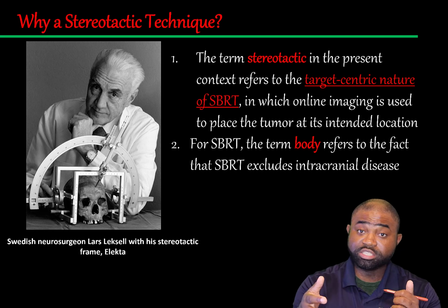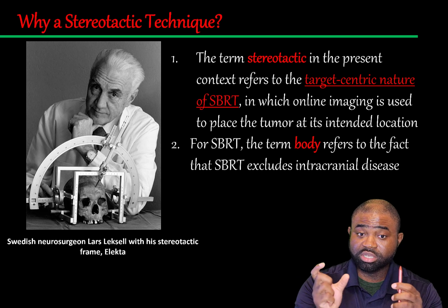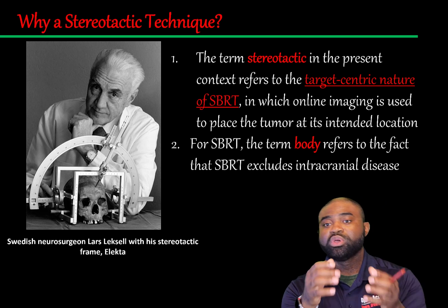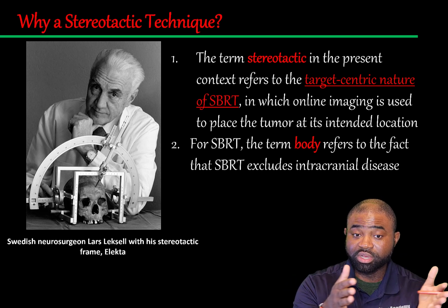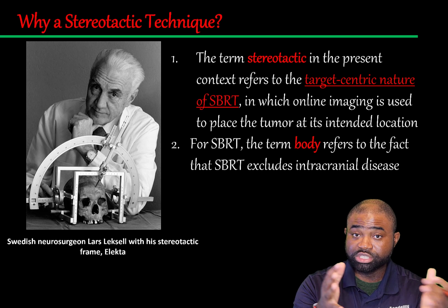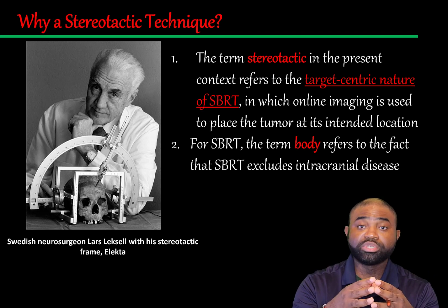To end this slide, stereotaxy is a central concept here, and refers to a procedure in which a point within the brain is localized with the use of an external fixed three-dimensional reference system, such as a rigid head frame, that was initially used in neurosurgical procedures.